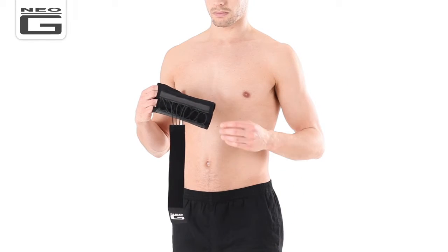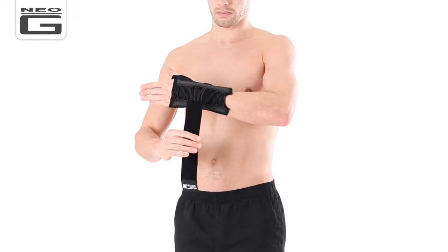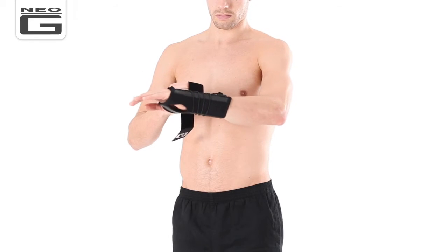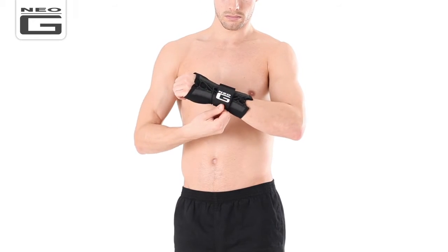The innovative EasyFit design allows for quick, simple application — easy on, easy off. With the splint sitting on the palm side of your wrist, slide the left or right hand into the support and through the thumb opening. Wrap the long outer strap around your wrist and fasten once you have achieved the desired level of compression and support.